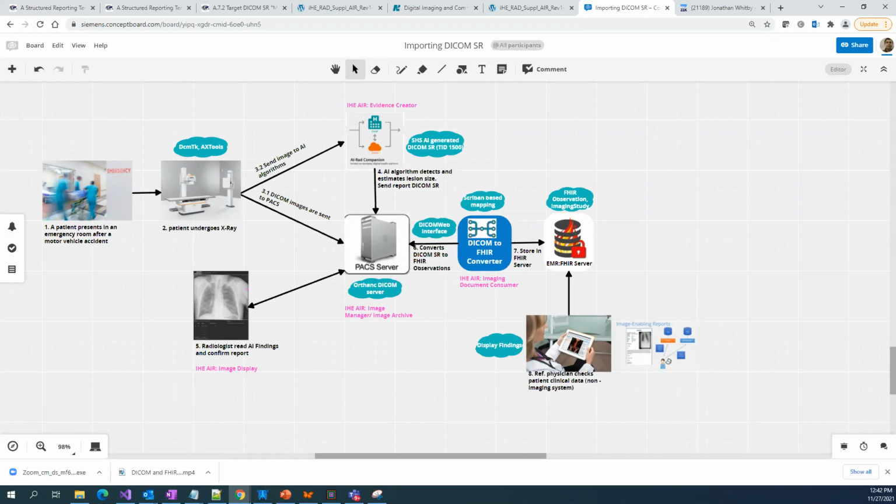So it appears to me that we just sell PACS to hospitals and some viewer on top of it, and they get the job done. Not really. At least some of these products, GE, Siemens, Philips, which they are selling in India, also have the IHE profile. They have to do it.